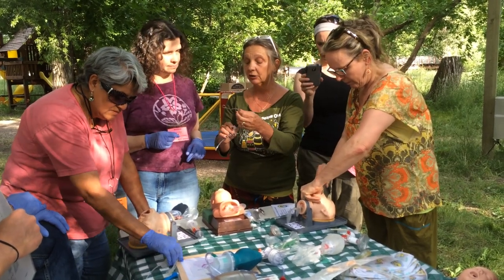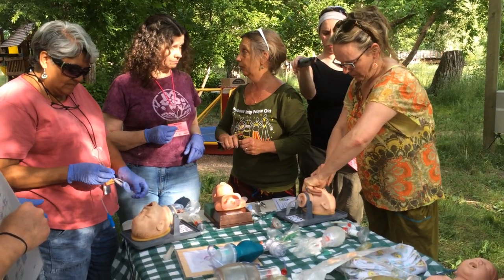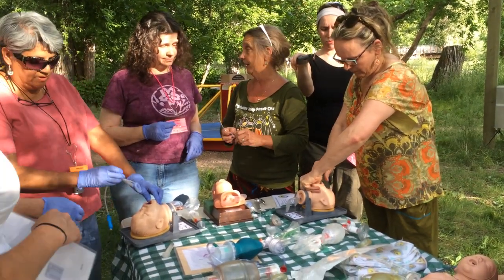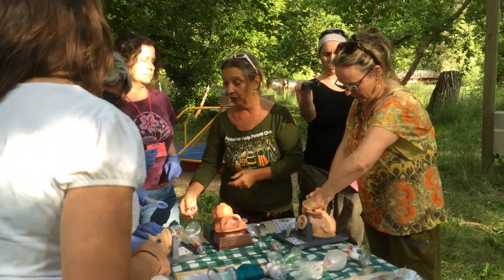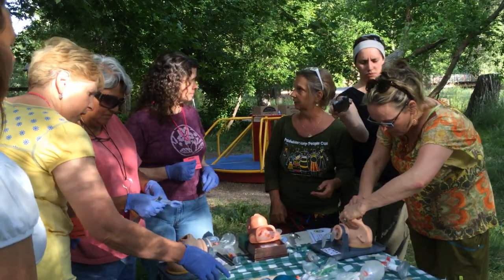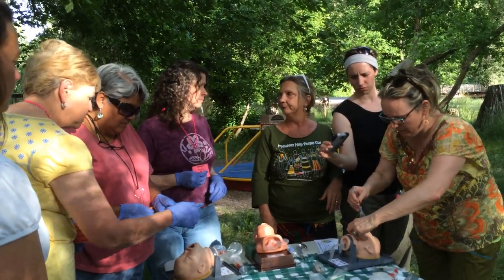It's just a good thing to see what it is that you're not having to do as a result of knowing how to use an LMA. And when you get to the hospital and you have an LMA in place and they go, oh, look, the chest is rising, she's doing a great job, right? You're one step up from the other guy.